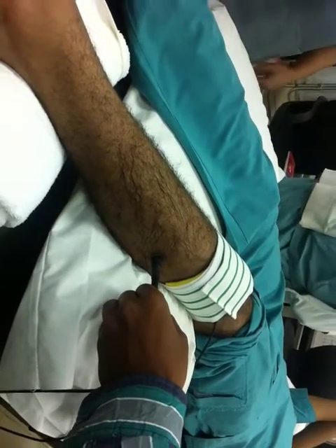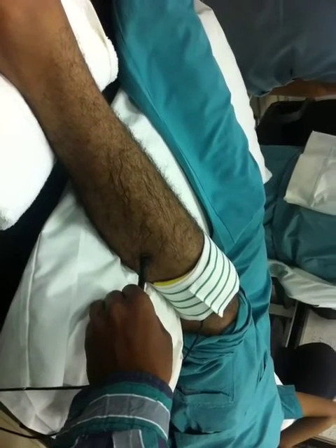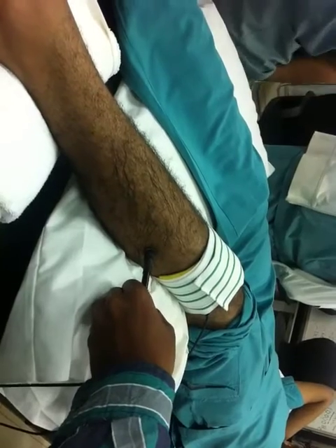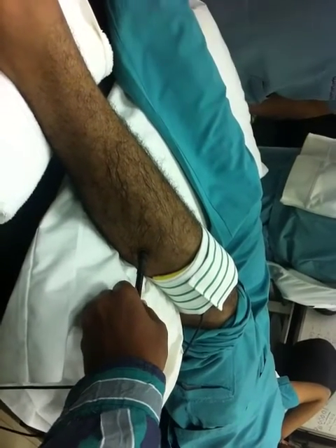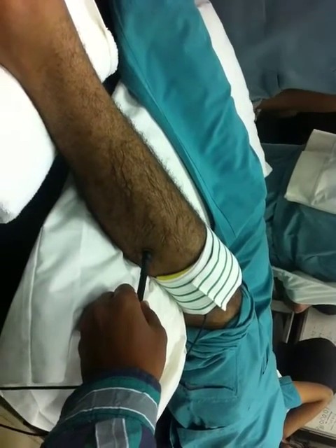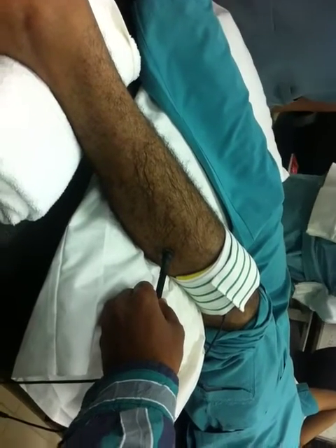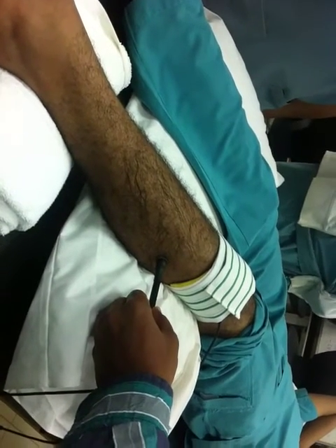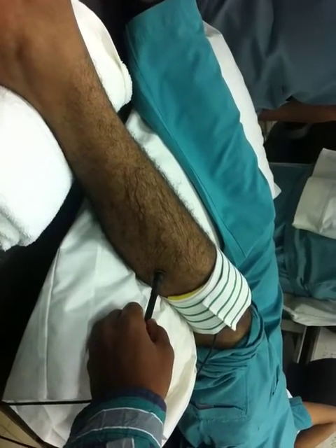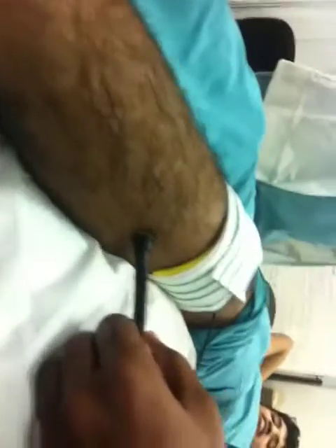He asked a question about whether if a patient has hair, you can treat him or must you remove the hair. It's very difficult — the resistance will be more. Sometimes he will feel discomfort. You have to remove the hair. But if he allows it, it's for his muscles. You can see the contraction here — you can see the muscle contraction.